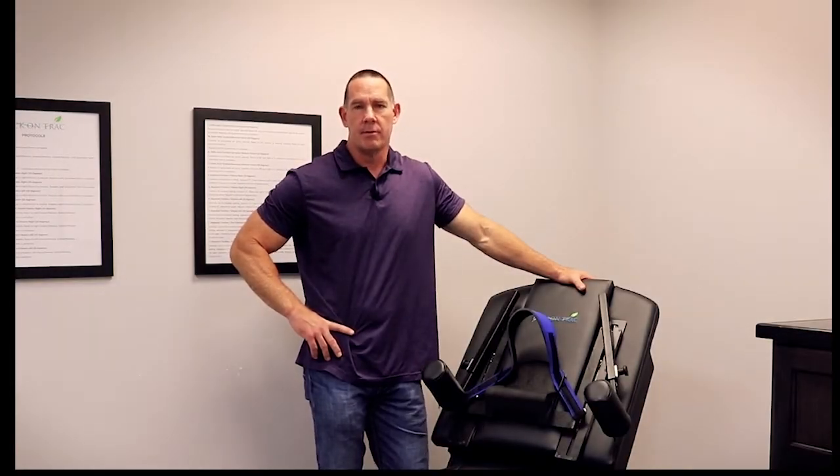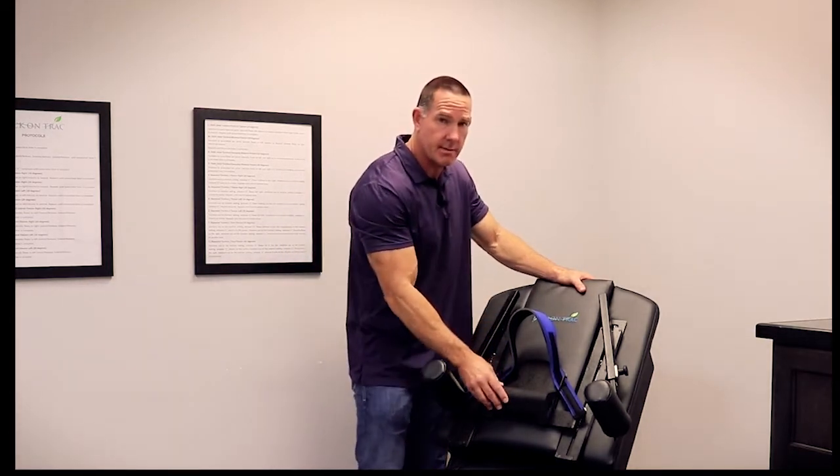Hello, I'm Dr. Rob Mayer. I'm the Chief Clinical Director at ErgoFlex Technologies. And today I want to go over how to properly set somebody up with our server track unit.